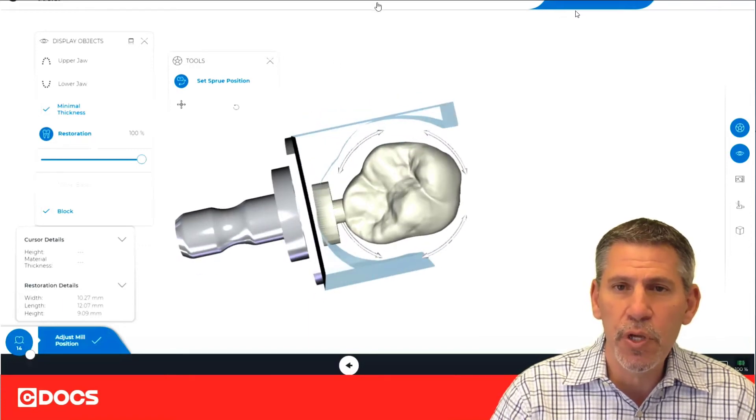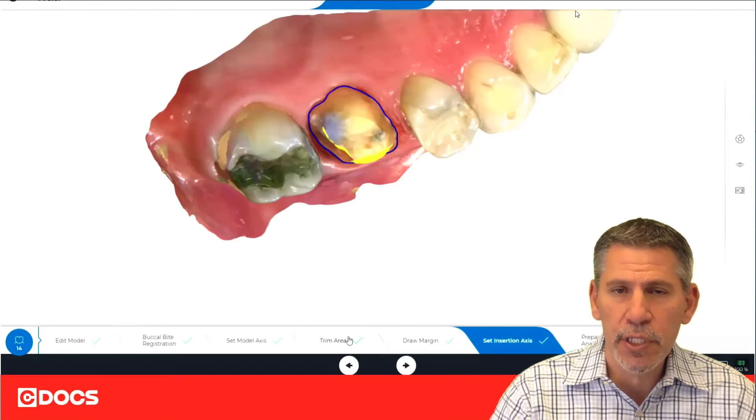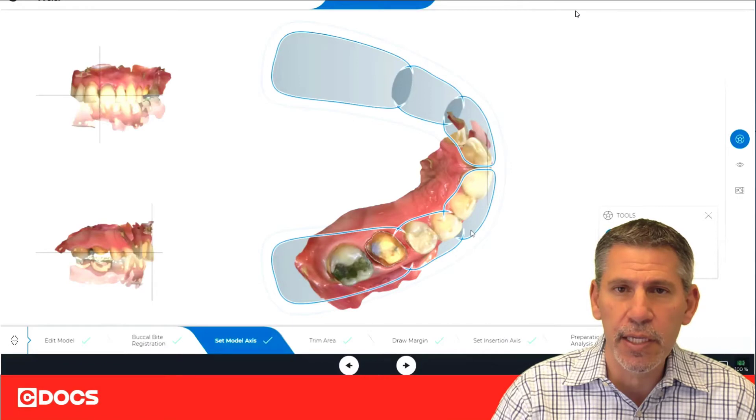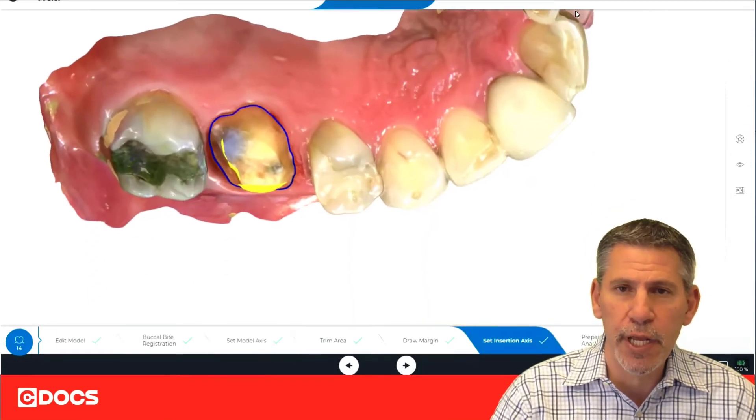Moving the sprue alone isn't enough to generally fix that. There are a couple of things that we want to check, and we want to check this early on before we go to the design phase. Number one is make sure that we've got our set model axis. This is an automatic step, but we still want to ensure that it is done properly. And then our insertion axis.